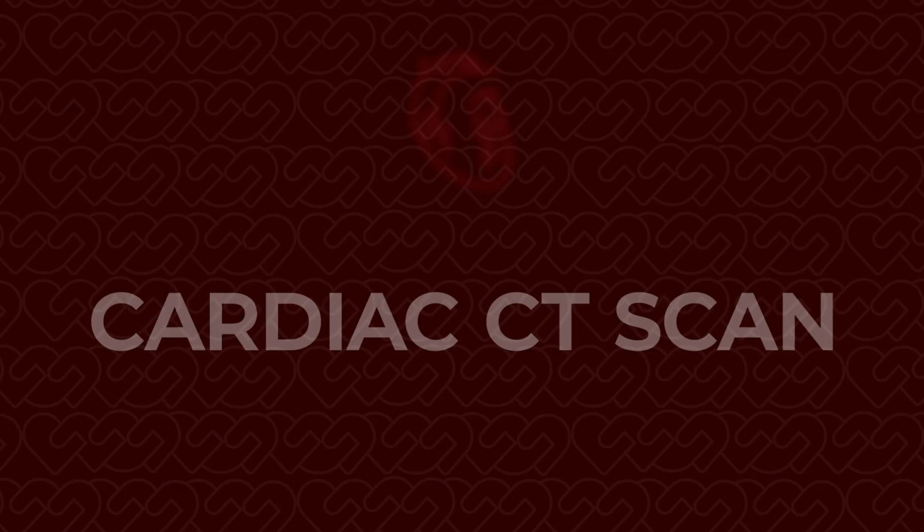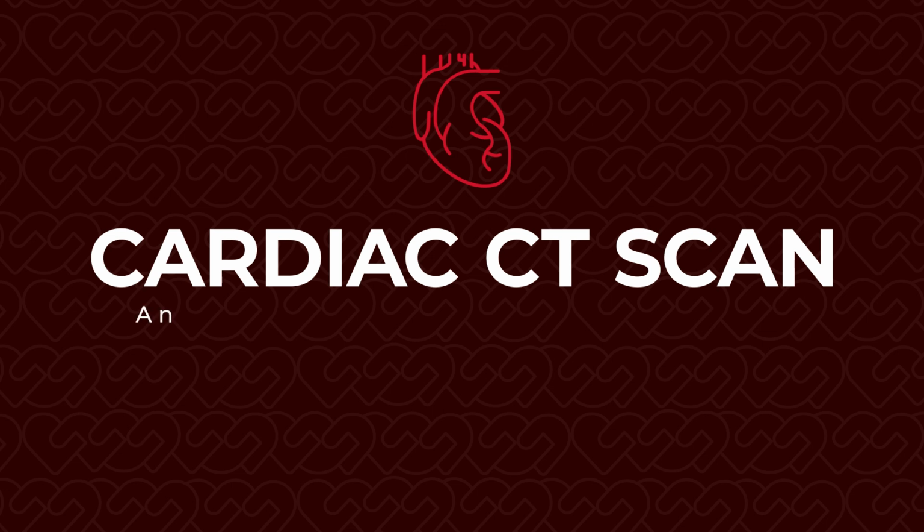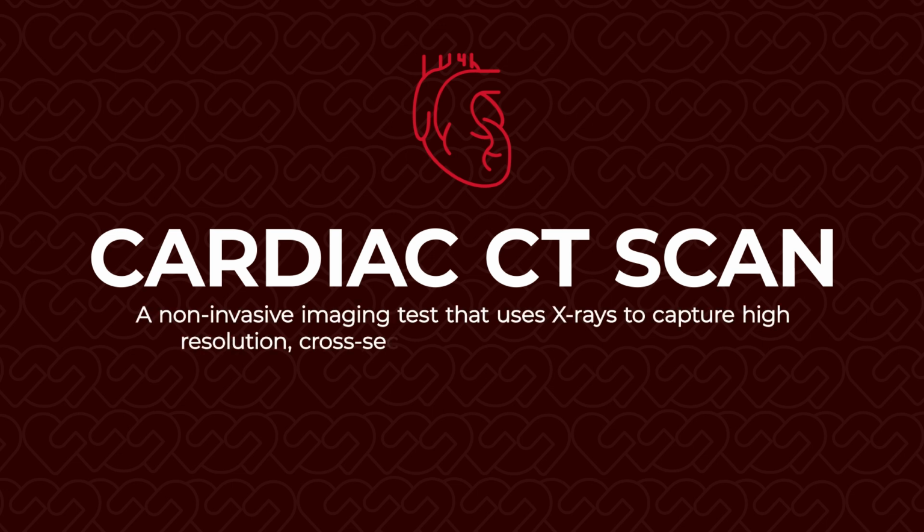A cardiac CT, or computed tomography, is a non-invasive imaging test that uses X-rays to capture high-resolution cross-sectional images of your heart and coronary arteries. The images then undergo post-processing to generate angiographic images of your coronary arteries and 3D images of your heart.